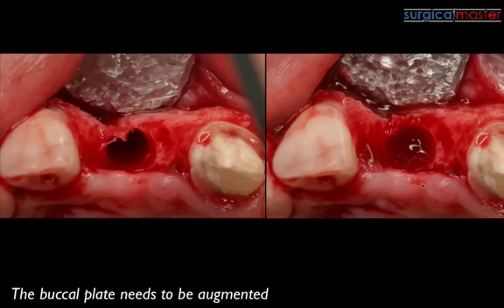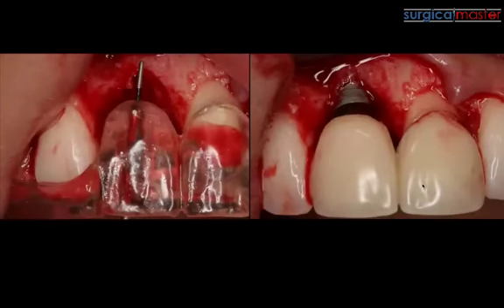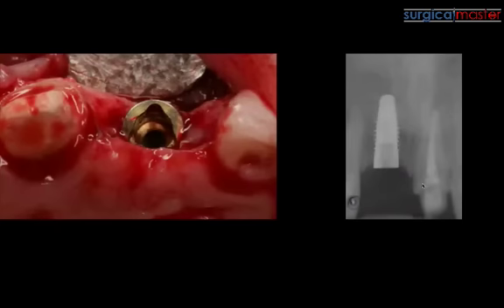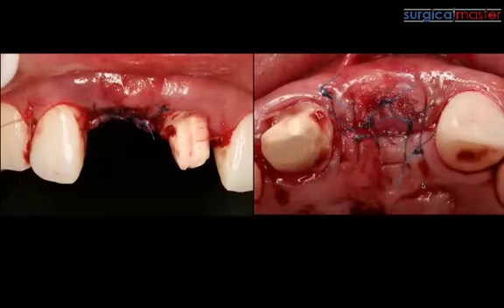So I'm going to use the compartment technique, and of course, I'll have to make sure that I place my implant in the right restorative position, and also from an apical coronal position, I need to make sure that I've submerged it enough to have enough room for an emergence profile. But the compartment technique is going to become useful also around implants. So if your ridges are deficient, use some sort of slowly resorbing graft on the buccal, and use your collagen membrane and close the tissue.